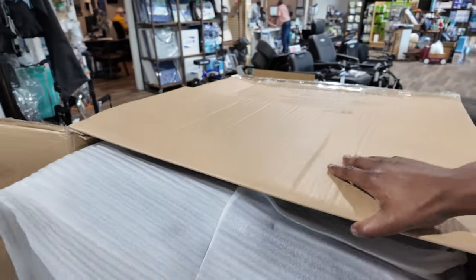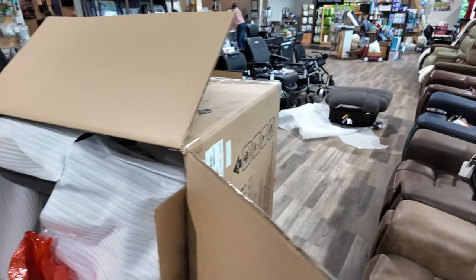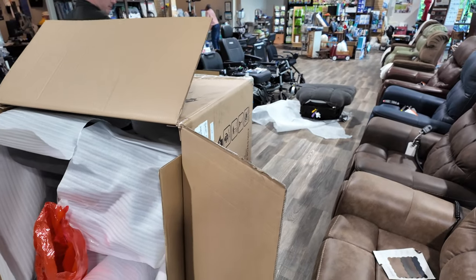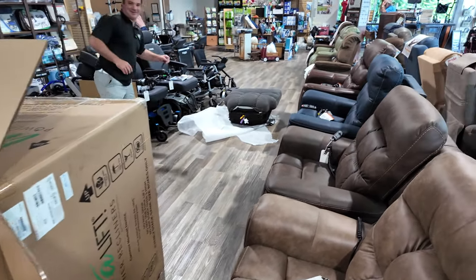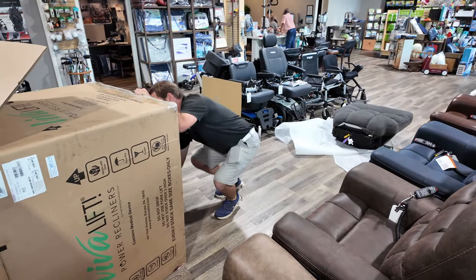It'd be easier to just cut that. Why are you all making me unbox this thing? I'm just going to cut down here.